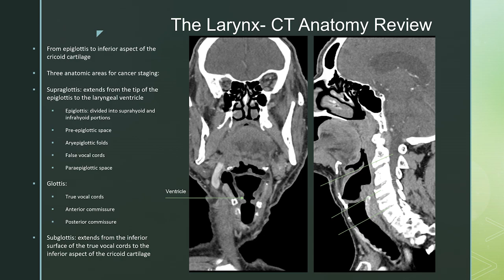For a brief review of the CT anatomy, the larynx consists of the structures from the inferior aspect of the epiglottis to the inferior aspect of the cricoid cartilage. There are three anatomic areas for cancer staging. The supraglottic region extends from the tip of the epiglottis to the laryngeal ventricle, which you can see best on the coronal view, where you have that goblet or hourglass shape. The ventricle is the space between the false vocal cords and the true vocal cords.